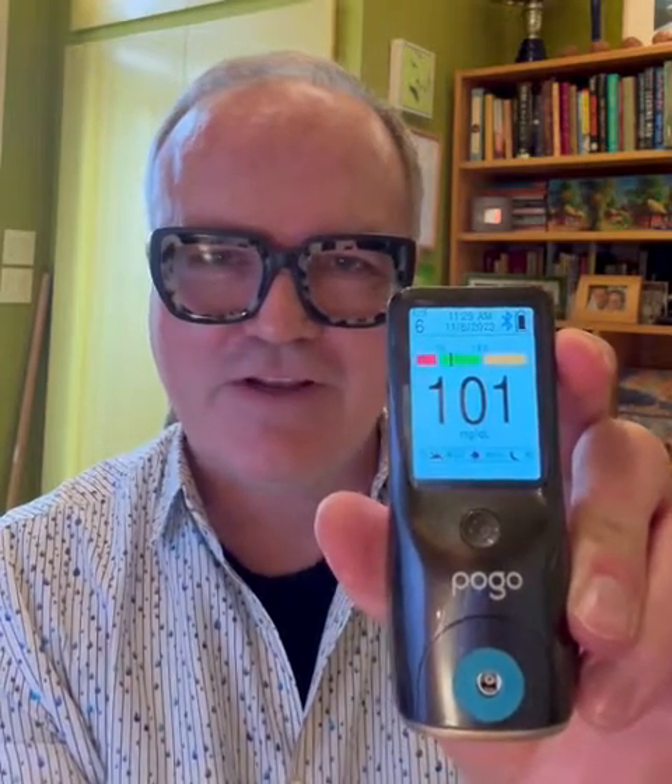And there you have it, so convenient and easy to use. That's the Pogo Automatic. Thank you.